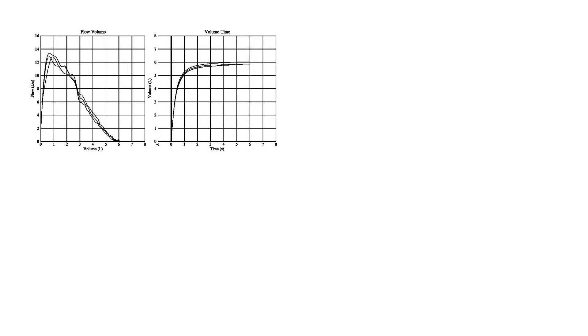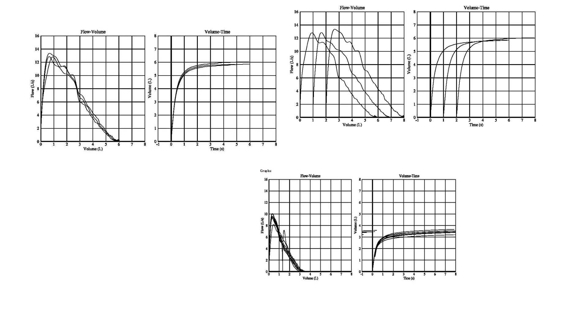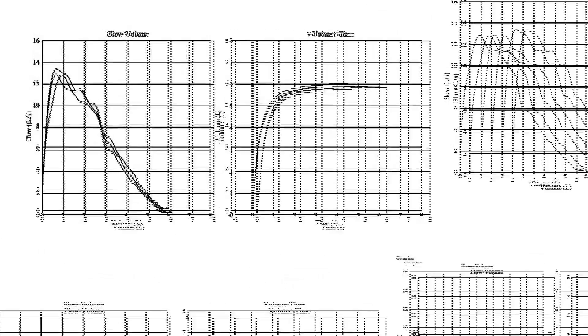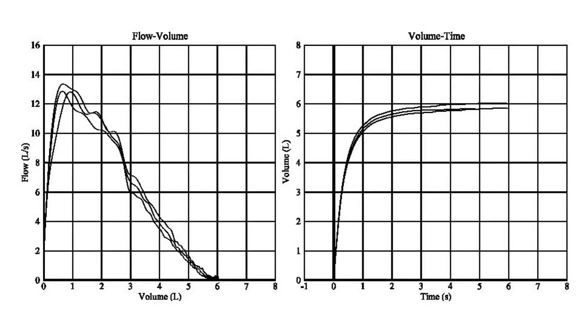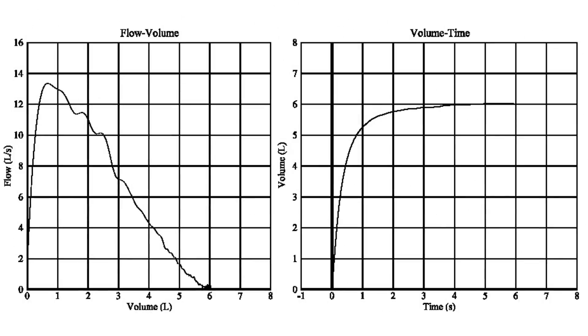The CCS200 Plus software has flexible options for displaying spirogram graphs, and we can use this to cut through the clutter. One of the options is to display only the best three maneuvers, or maybe only the best individual one.